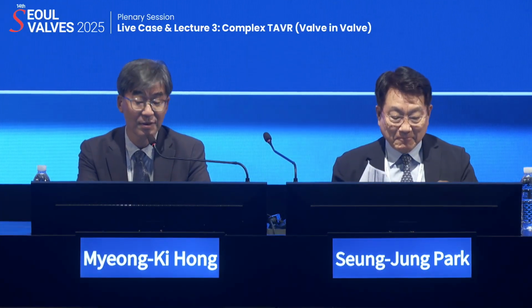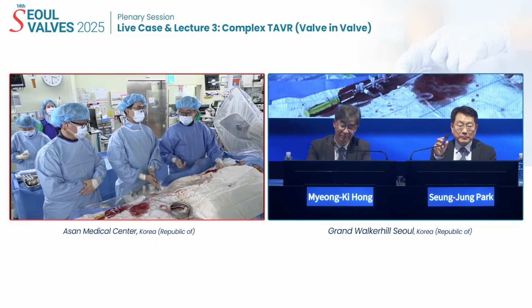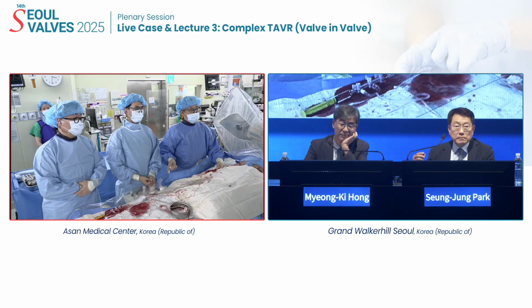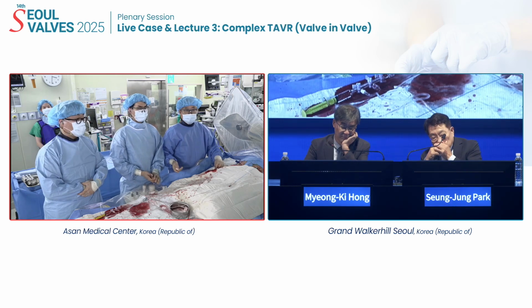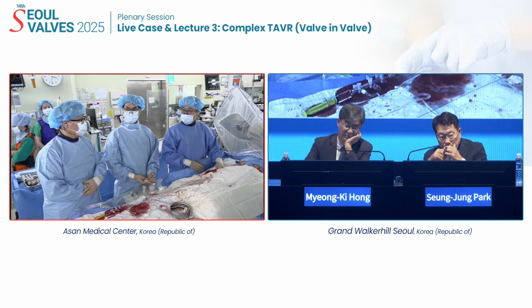Okay, let's start the live cases. Case number 6. Dr. DW Park, are you ready? Can you hear me? Okay, please start. Okay. I'm DW Park, and this session is a valve-in-valve session. I'm going to introduce our team: Jinho Lee, who is now a professor at Kyunghee National University and graduated from our fellowship, and also Seung-Jung Lee, our senior fellow. Okay, can you introduce the patient background?